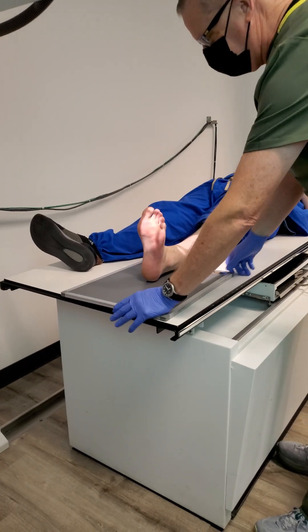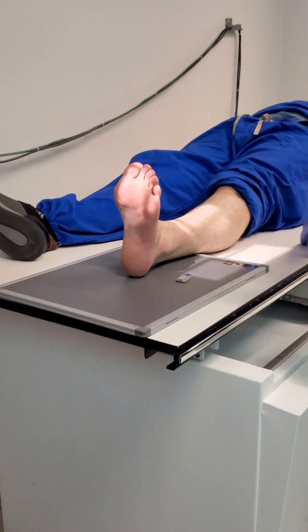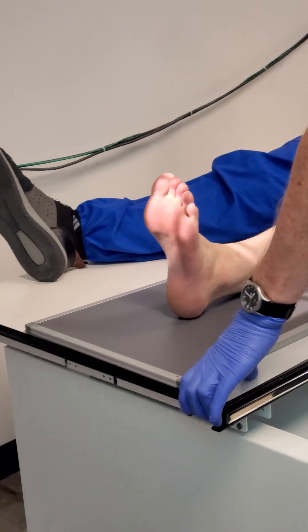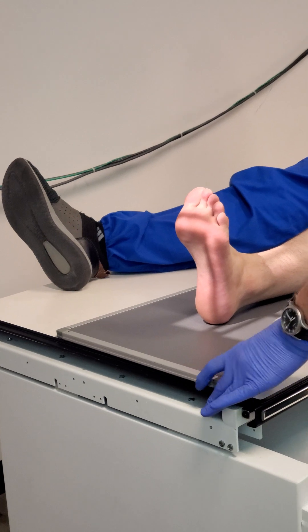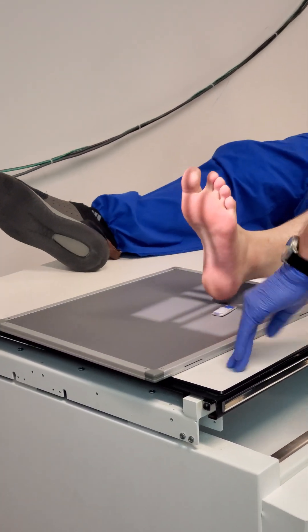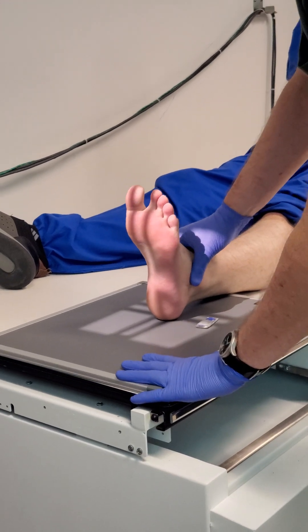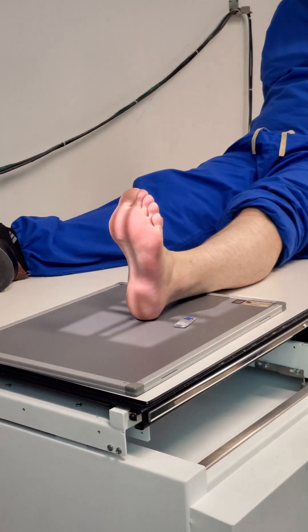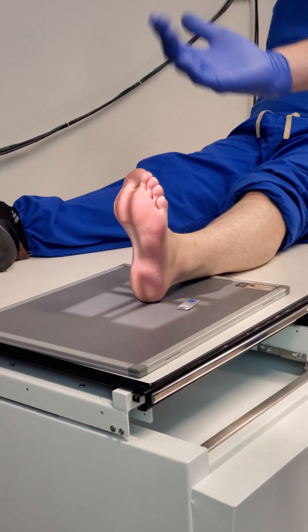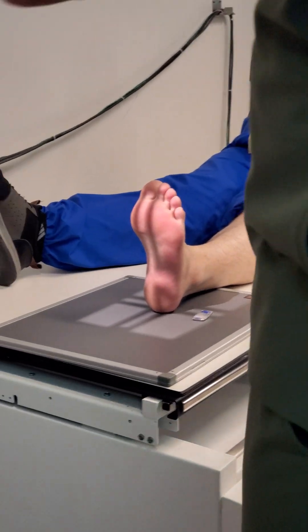What I'm going to need you to do is dorsiflex your foot 90 degrees — can you do this comfortably? I'm going to move you back a little bit more. You're going to have to scoot up just a smidge. Part of the battle is getting your patient situated on the table properly so you can get what you need.